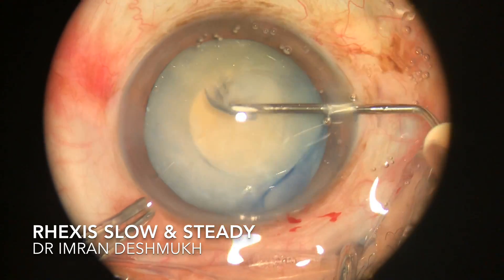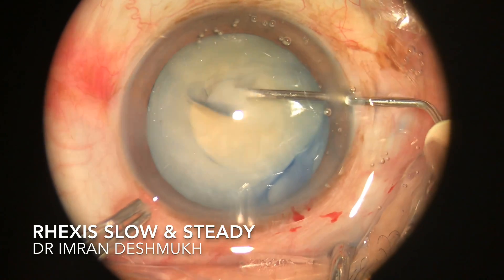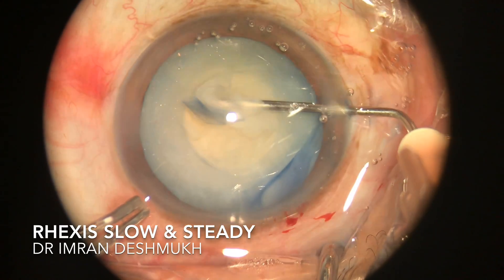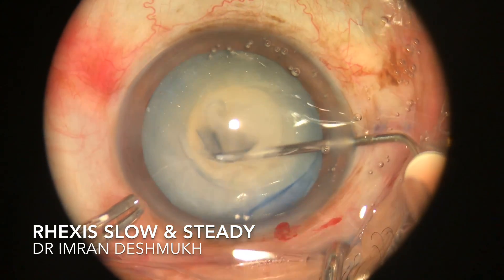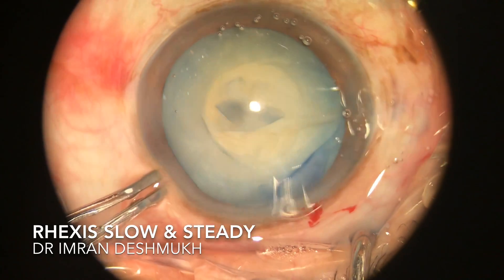This is the most important and toughest part of the surgery in my opinion. Once you get a good rhexis, the rest of the steps can be easily taken care of. Thank you.